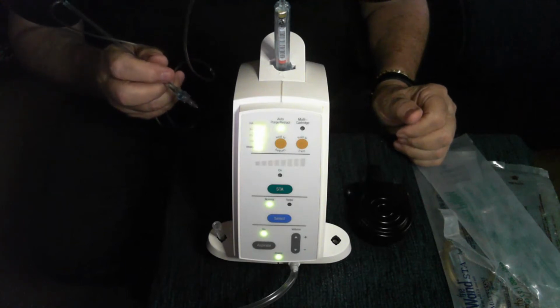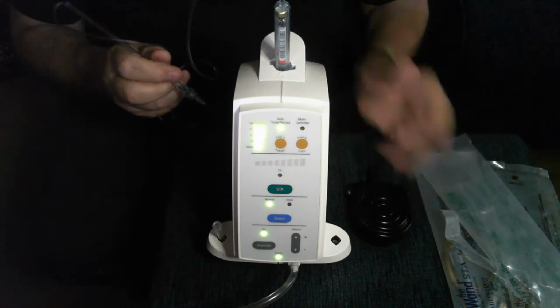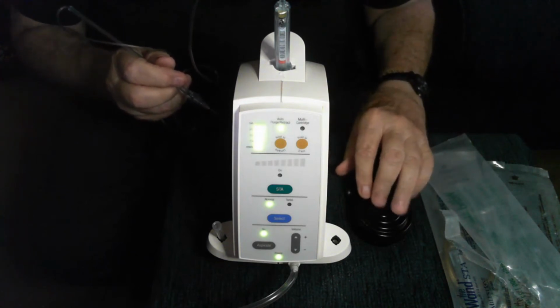After 3 beeps, the voice said cruise. I took my foot off the foot pedal. Now I'm in cruise control. It's going to stay at that flow rate until I tell it to stop. You don't have to have your foot on the foot pedal throughout the whole injection.